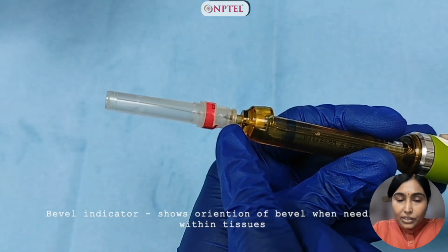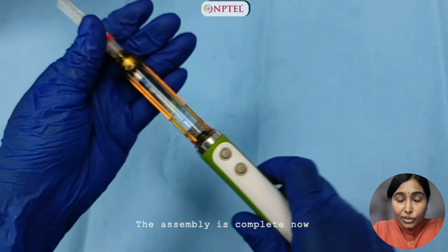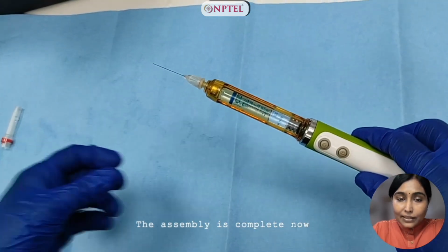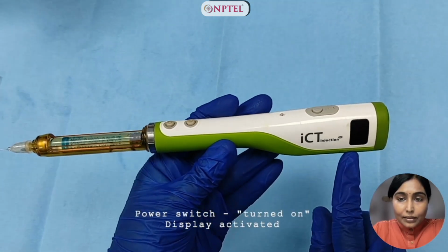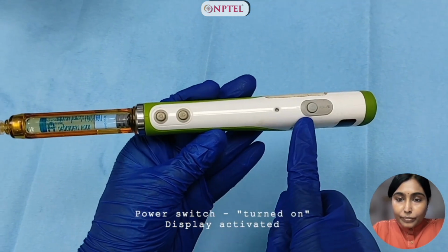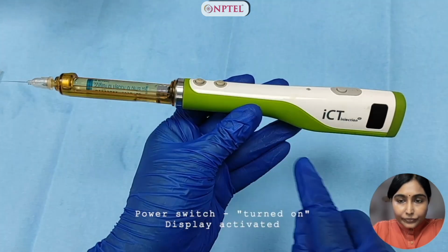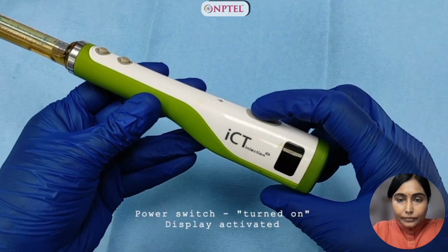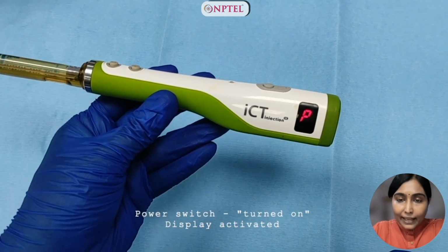Now this is very interesting. You have a bevel indicator, the black arrows, which shows the orientation of the bevel to identify once the needle is inside the tissues. So now the assembly is complete. We're going to start now. The power switch is turned on. Once it's turned on, you see the display activated.